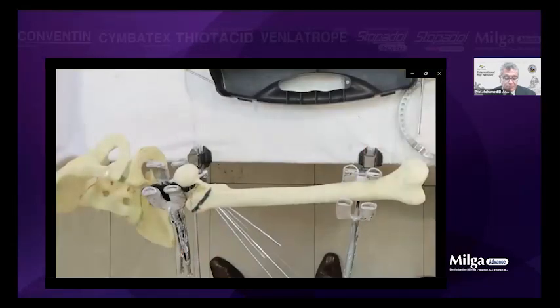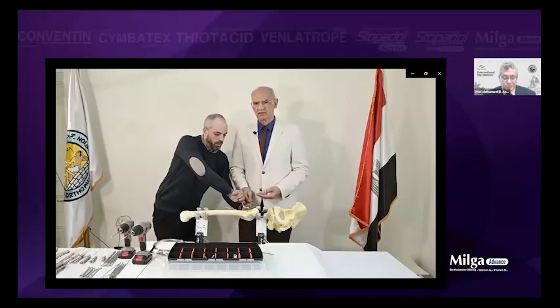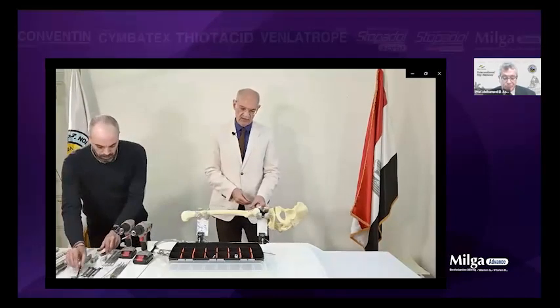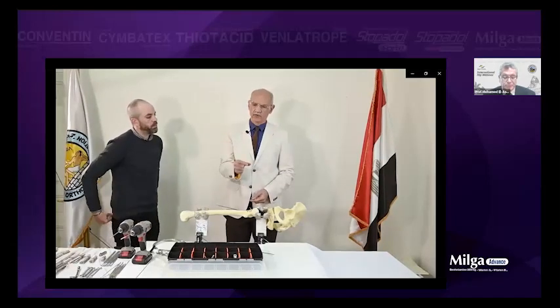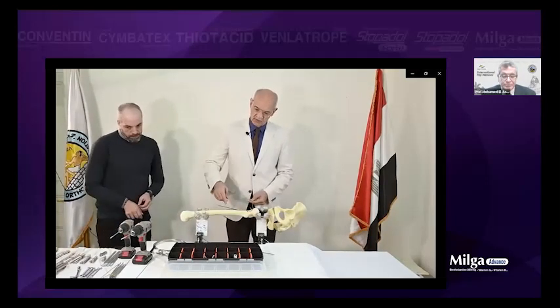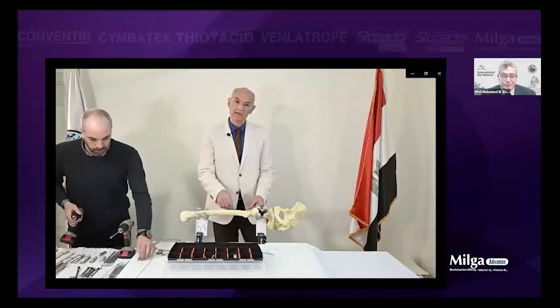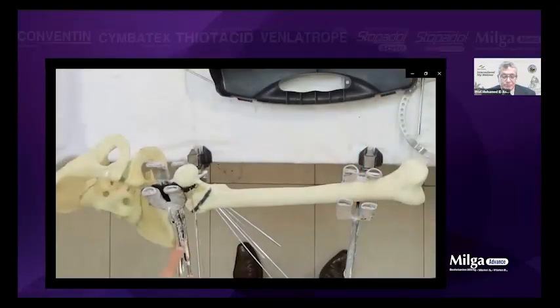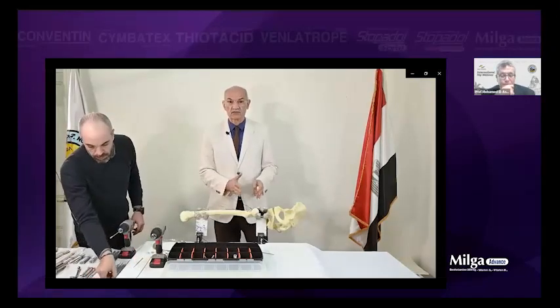Take care, you need long serrations. That means you need 6 centimeters, 6.5 centimeters, 7 centimeters, so you have a big length. It's longer than normal, so you need half pins with longer serrations. It's not just 3 or 4 or 5. If you manage to fix this in that direction, 90 degrees direction, or the direction of the neck, you can use both. In some cases, we used both of them. In some cases, we can use wires and this half pin. And I will show you on the slides. You can make any mixture.